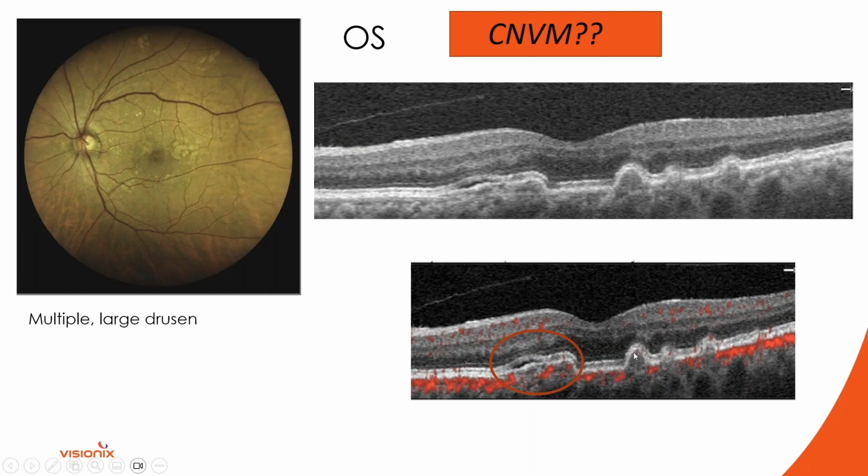When you have a drusen, like here, here, and here, you'll notice that there's no pixelation running within the drusen. Here, you can see that there's increased blood flow in that area, which really concerns me. And that was what I was telling you before, that you have to also learn to look at your flow overlay images for areas of increased pixelation and areas where perhaps they shouldn't be. Why would you have increased pixelation within a pigment epithelial detachment unless there was blood in there?